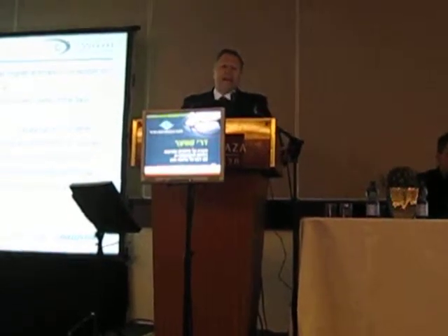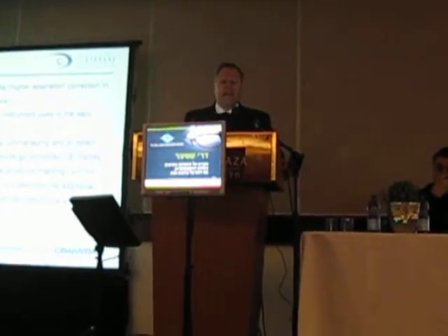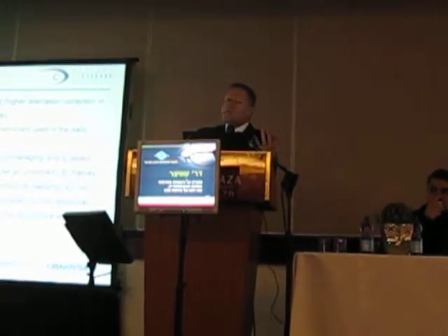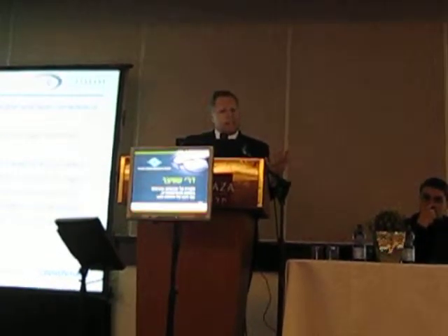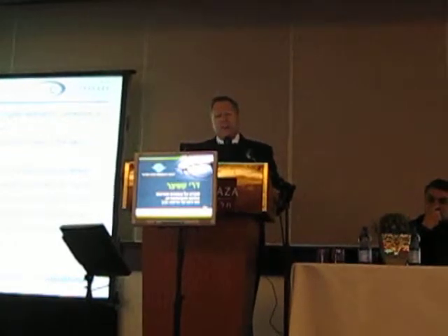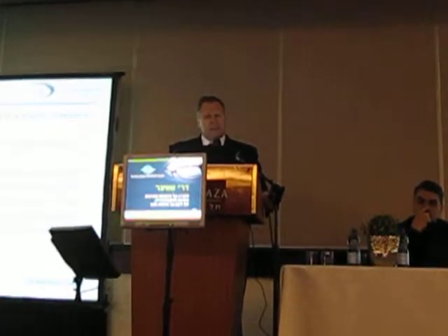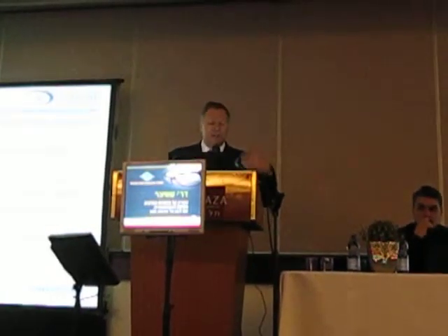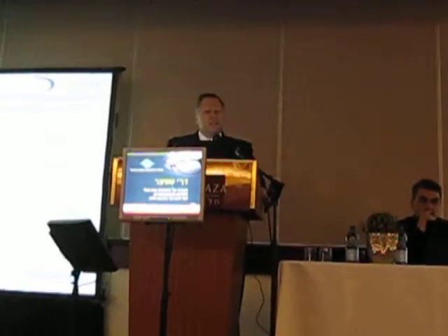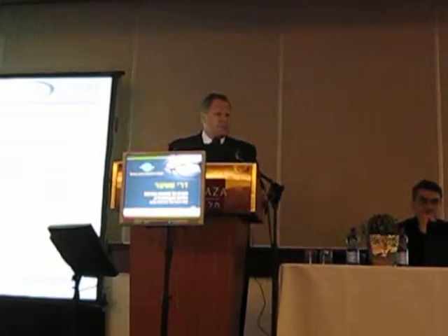In general, as always with instruments, I want to point out and stress what Dr. Twa had said at the BCLA, that the more data you have, the more information you have, you sometimes go overboard in interpreting the data or trying to explain and use all kinds of data. I think what we should consider here is what was promised with the higher aberration correction in refractive surgery, the LASIK kind of treatment with higher aberration correction, and the so-called eagle vision, and it hasn't fulfilled its promises. A lot of information, new technology, but yet the promised eagle vision hasn't really materialized.